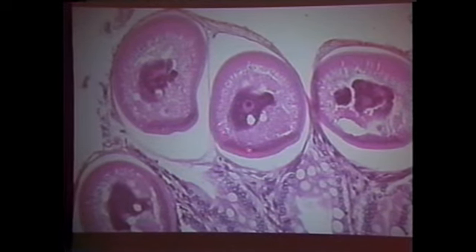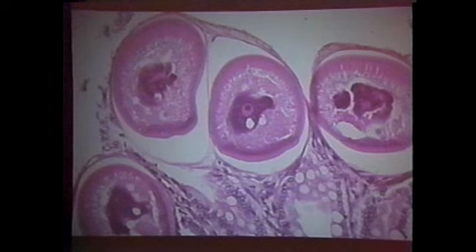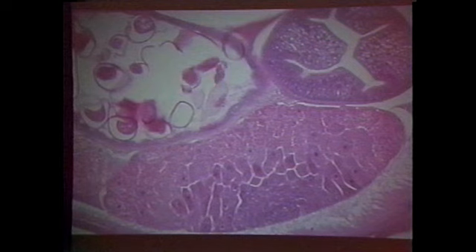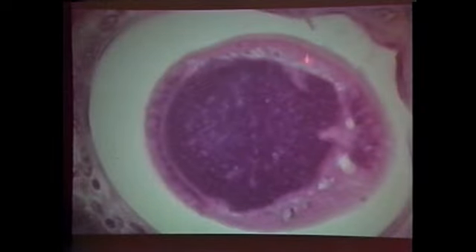Here we go around the worm. Do you see any lateral cords? No. Aphasmids have no lateral cords. All right, this is a female. Here is a male. I just show you this is the large posterior portion. This is another stichosome from Capillaria.